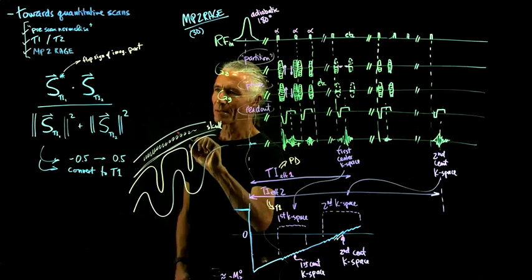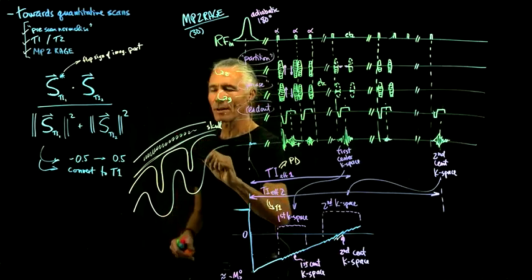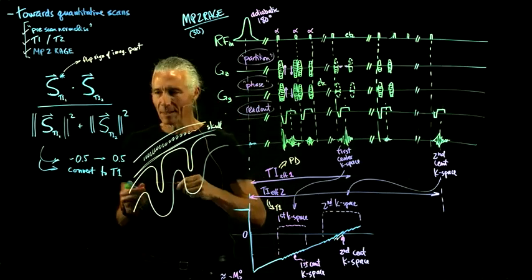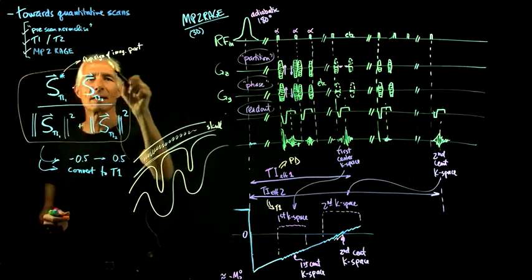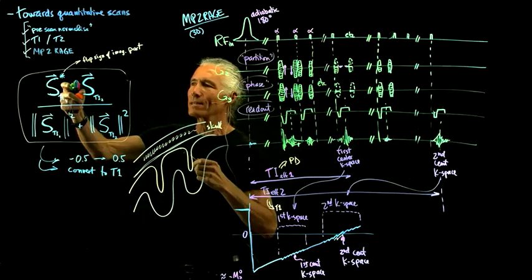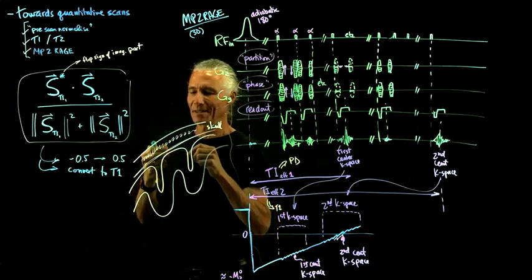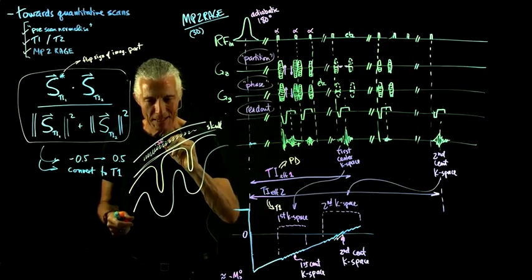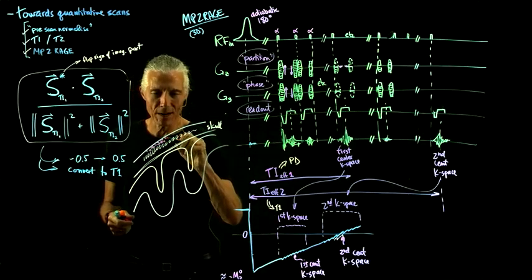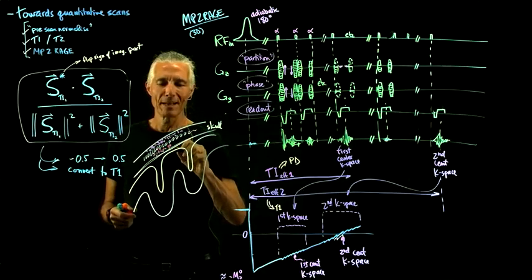This black is different from that black because there's no signal coming out of the skull. There's a big signal in the CSF, but for the skull it decayed away before I got a chance to record it. So when we do this calculation here, we divide a small noisy number by itself, and what do we get? We get a bunch of junk. When you process this image, you'll see there's just complete speckled black and white noise in here. It's not black anymore.